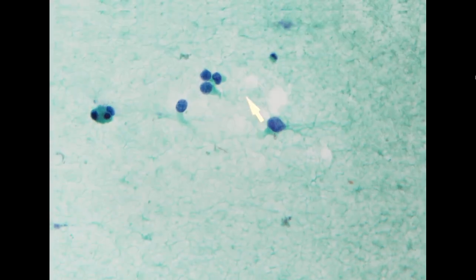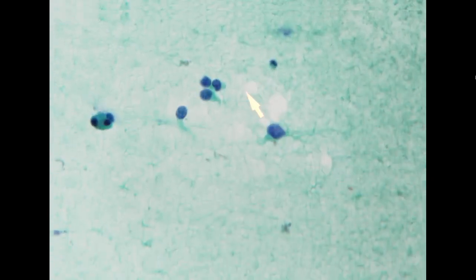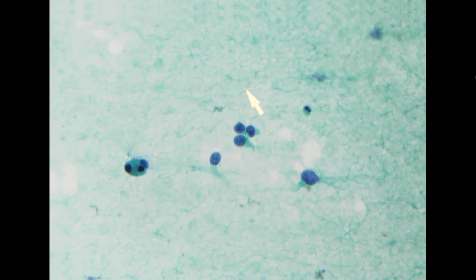The biopsy is GATA3 positive and P40 negative. If it is urothelial carcinoma, it can also show a squamoid morphologic pattern, but usually the P40 will show co-expression along with the GATA3. But in this case, we see GATA3 positive, P40 negative, so it is most likely coming from the breast, and the patient doesn't have any history.